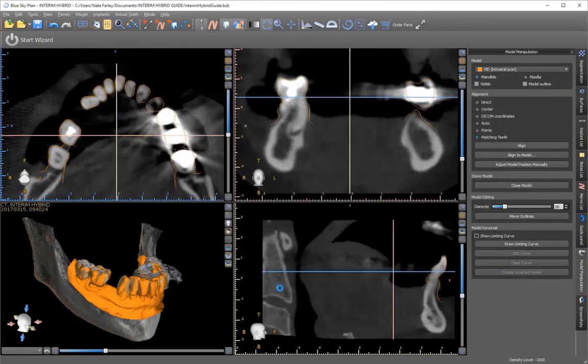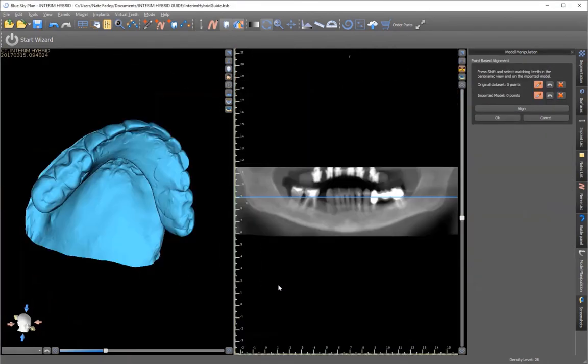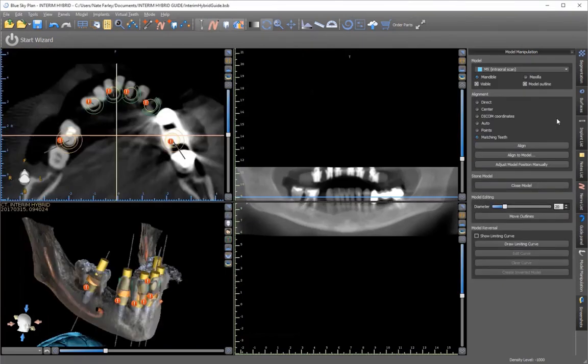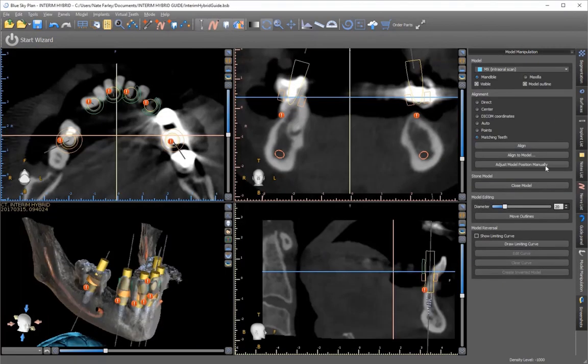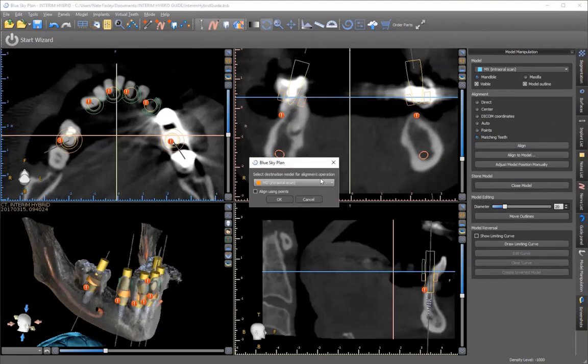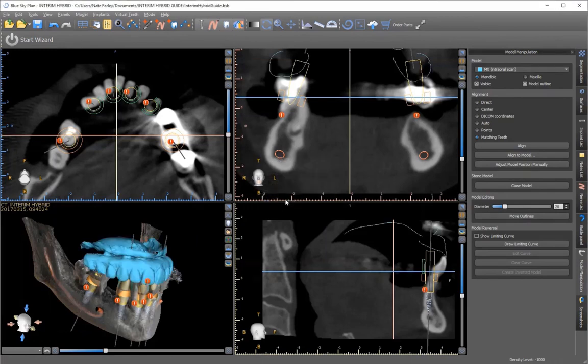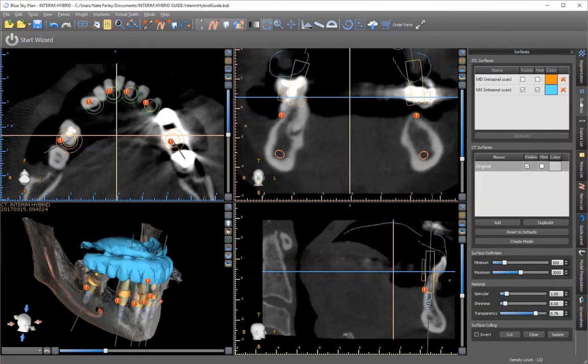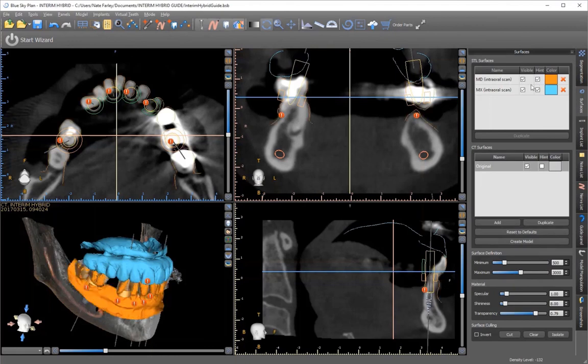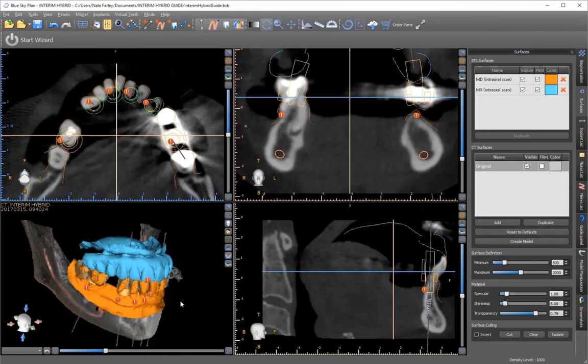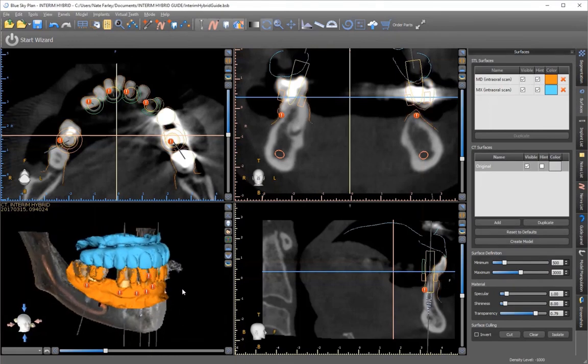we're bringing in the maxillary arch. We don't use this screen. I just hit cancel because I can actually align it to the model I already aligned. We just need to choose that model and say OK. As you can see, it uses the same coordinates that came with that original model to position the second one.